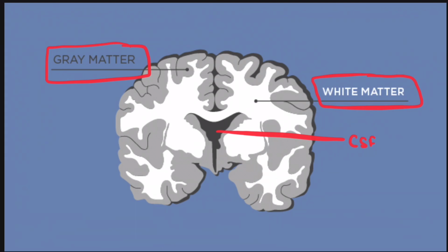So how to remember these parts? As you can see, this white matter contains the letter I. So I means inside. So anything inside the gray matter is the white matter. And you can remember this gray matter as, you can write G as this, you can cover this as this, complete the circle, and this is outside.